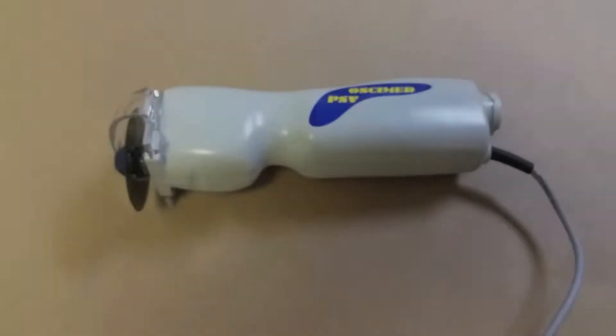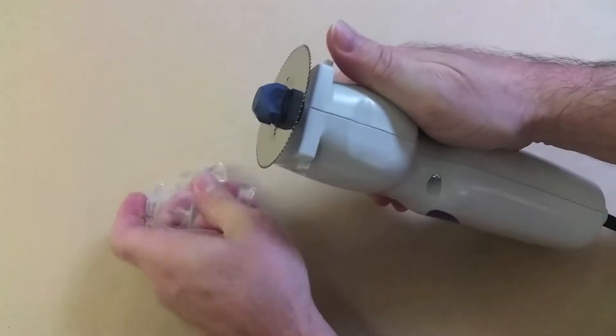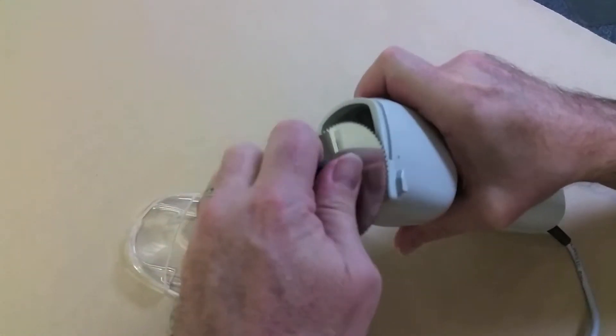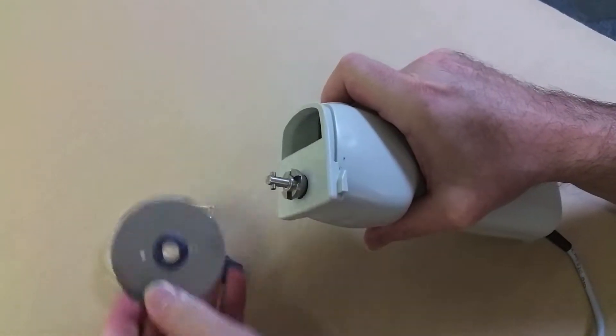To remove the blade, the plastic shield must be removed. Lightly depress the two tabs on the shield and slide the shield away from the blade and off the unit. To remove the blade, turn the hub screw by hand one quarter turn in either direction, then remove and set aside.